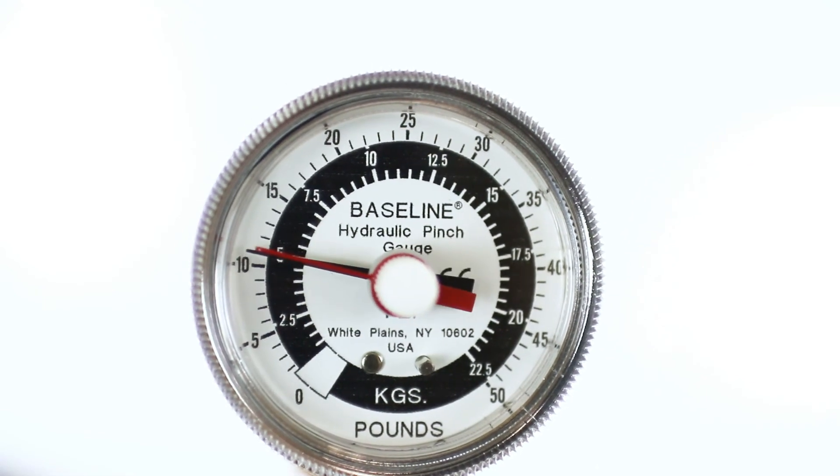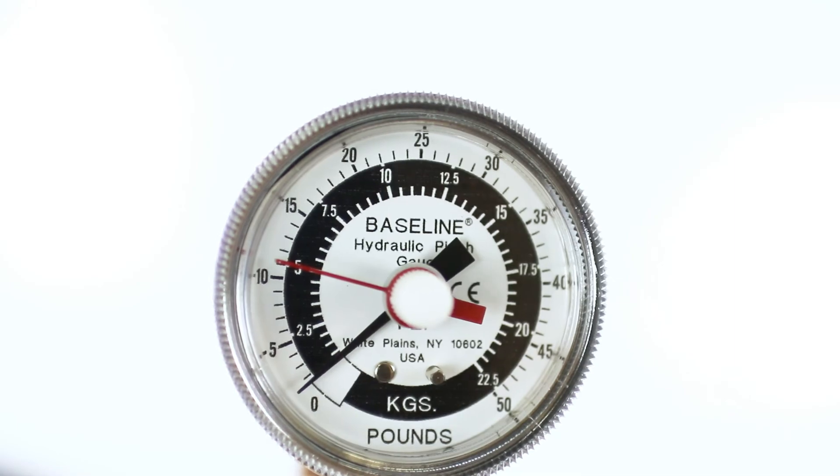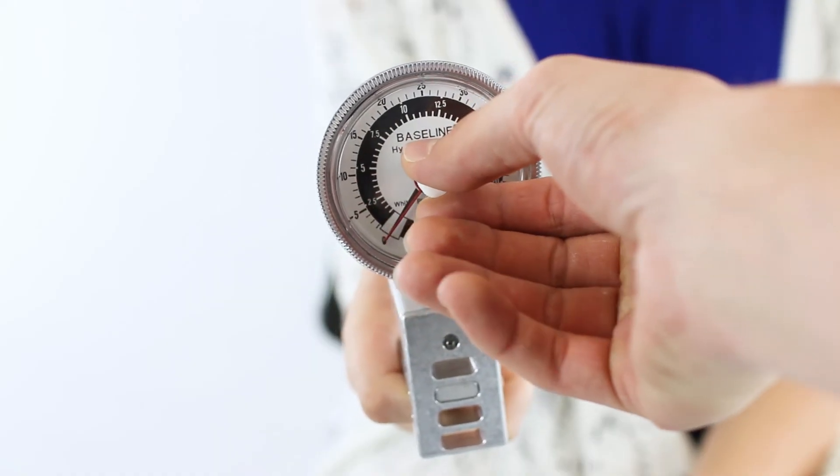Have the patient squeeze, hold, and release. Be sure to note the reading on the indicator. Reset the indicator to zero for the next test.